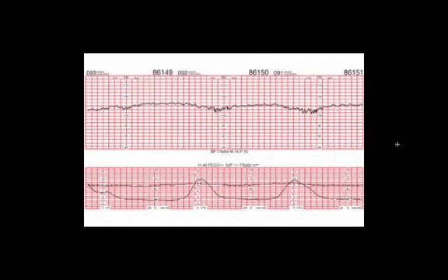And late decelerations, we know, are because of uteroplacental insufficiency, which means that we want to give this mom as much possible extra blood flow to her uterus as we can. We'll increase her IV fluids, we'll give her oxygen, we'll turn her optimally on her left side, or her right side would be fine too. If she's already laying on her left side with these decelerations, then let's try another side.